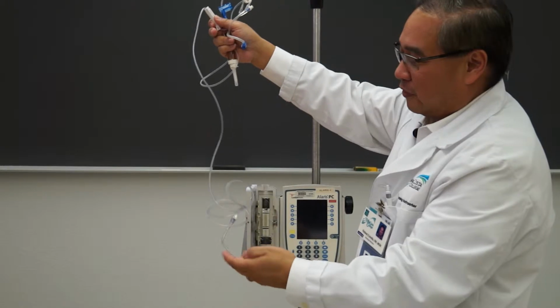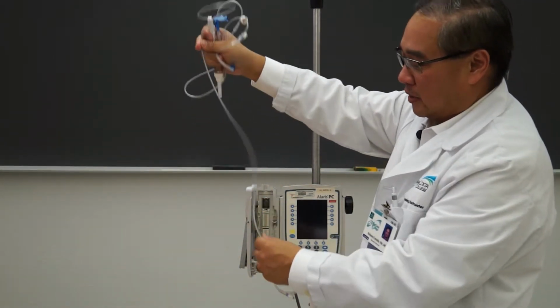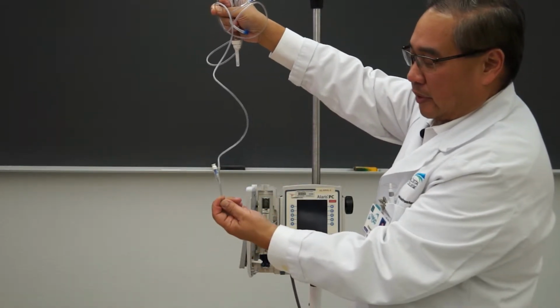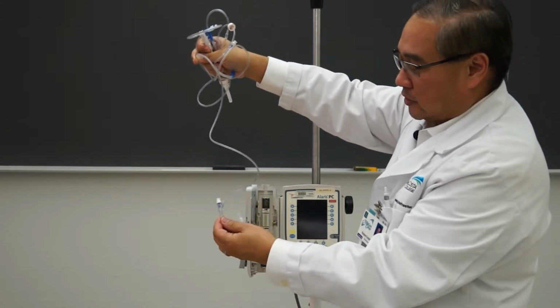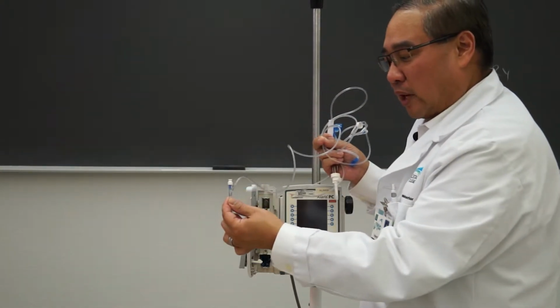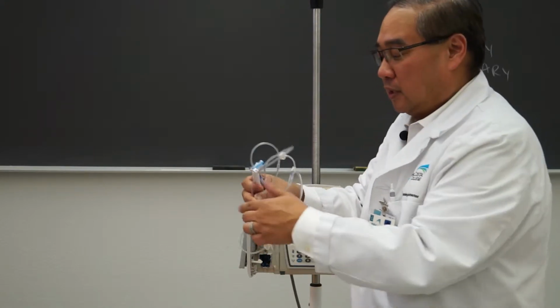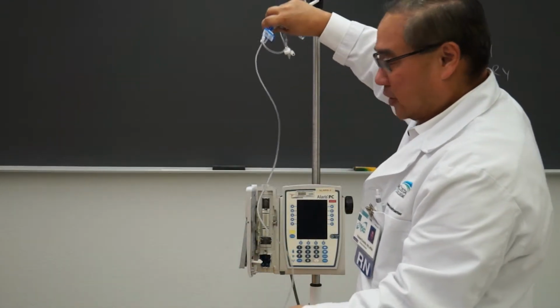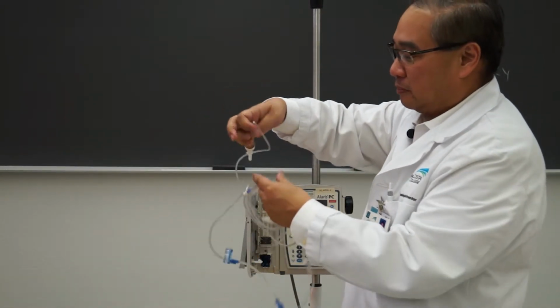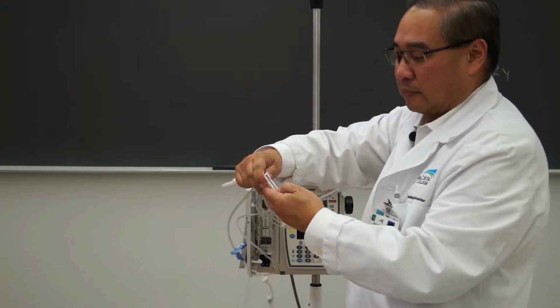I'm going to follow it down further. Remember, I'm controlling the ends at all times to make sure I don't contaminate my supply. There's no kinks, there's no abrasions, and there's another Y site here at the bottom. So I have two Y sites on this tubing, and why is that? Well, the closest Y site to the patient is where you'd be giving your IV pushes. The Y site closer to the pump side is where you would hang the secondary pumps, which I'll show you in an upcoming video.